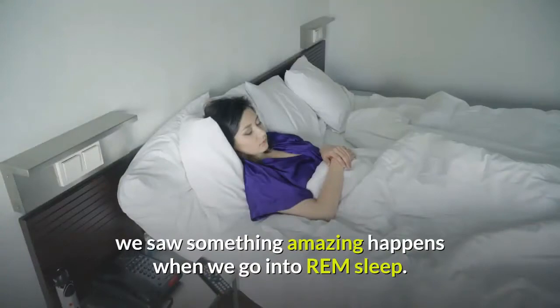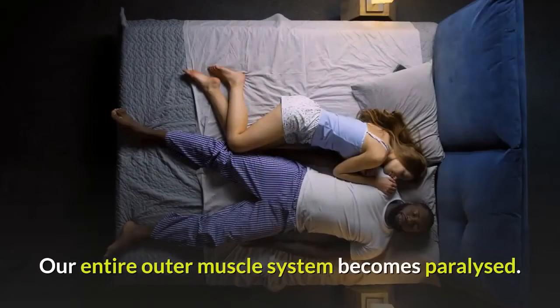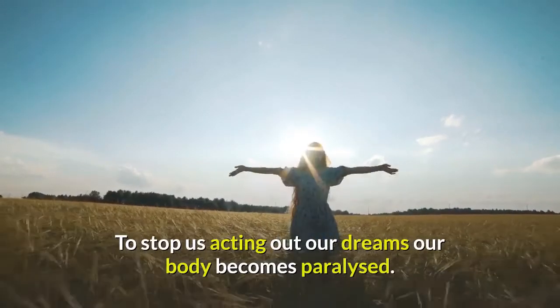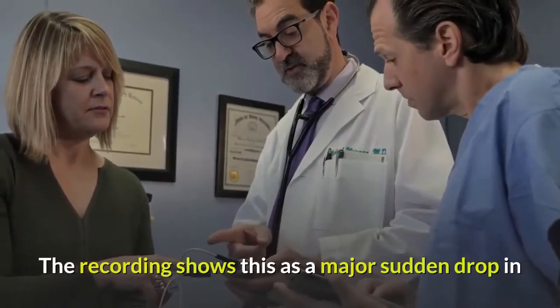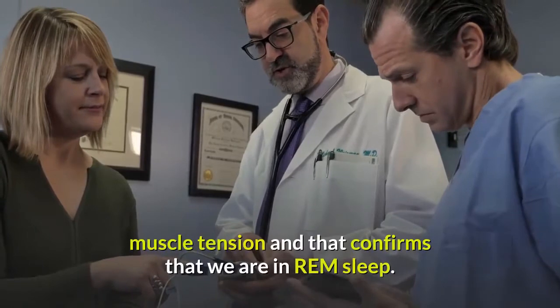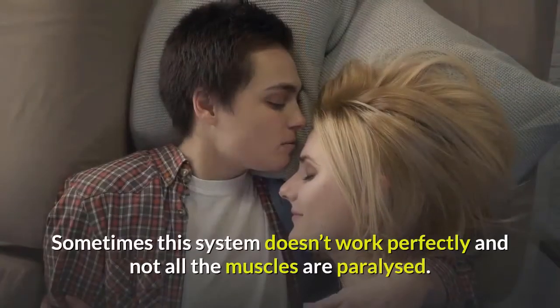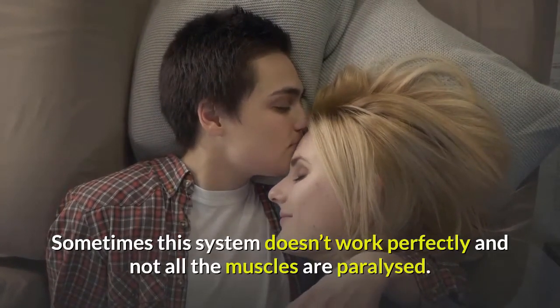Something amazing happens when we go into REM sleep. Our entire outer muscle system becomes paralyzed. To stop us acting out our dreams our body becomes paralyzed. The recording shows this as a major sudden drop in muscle tension, and that confirms that we are in REM sleep.